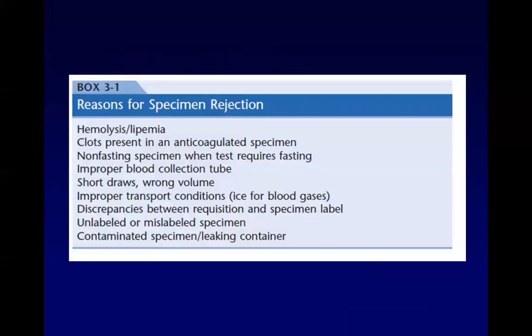Reasons for specimen rejection in the lab include hemolysis or lipemia, clots present in an anticoagulated specimen, non-fasting specimen when the test requires fasting, improper blood collection tube, short draws, wrong volume, improper transport conditions, discrepancies between the requisition and specimen label, unlabeled or mislabeled specimens with the wrong name, and contaminated or leaking containers.